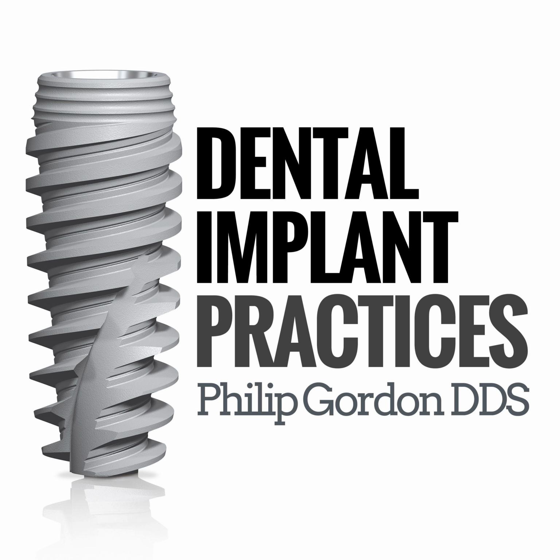What I like about these implants is all of them offer a small 3.0, and then they move into a 3.5, a 4.3, and a 5.0 with certain connections at the top that are all compatible. They all have a shorter implant, like an 8 millimeter, then a 10, an 11.5 length, 13, and 16. So there's a lot of variation depending on where in the mouth you're going to place the implant, and possibly what the focus of the implant is going to be.